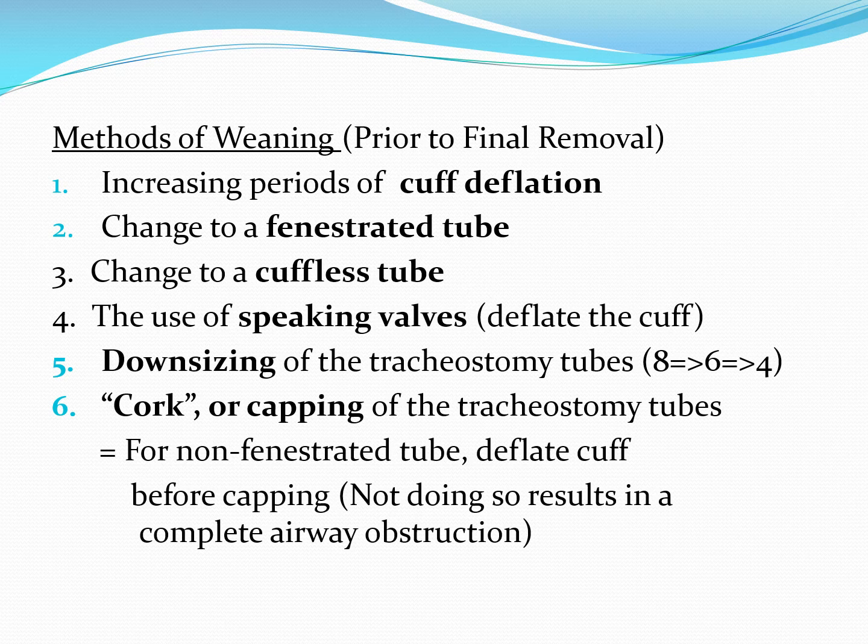So the patient hopefully has been successfully weaned off the ventilator, they've been off for a few days, so now we're really looking at periods where the cuff is deflated for longer and longer periods of time, change to a fenestrated tube, eventually hopefully change to a cuffless tube, combining that with speaking valves in order to build the patient up, their respiratory and speaking muscles.